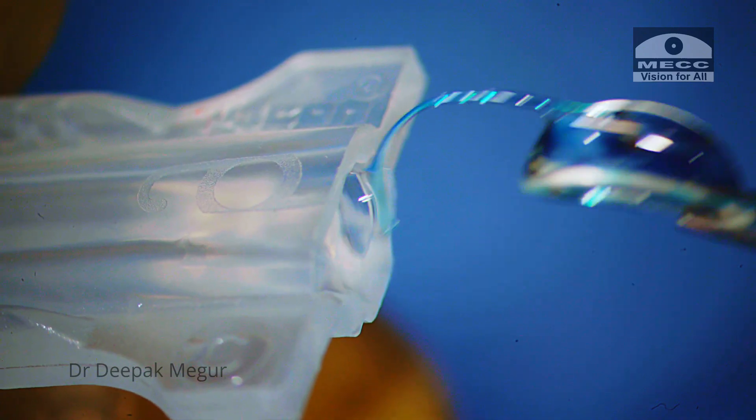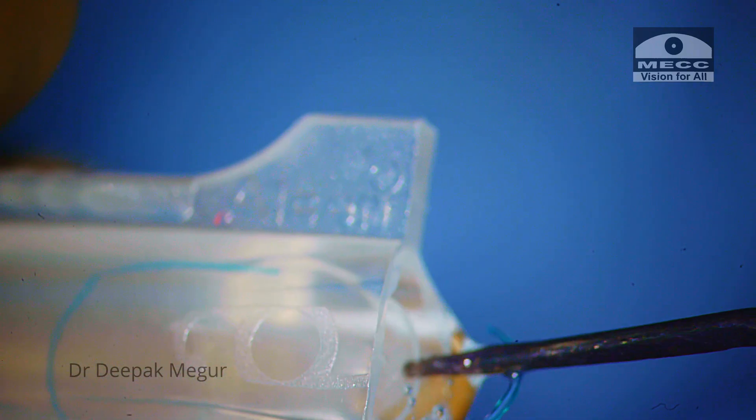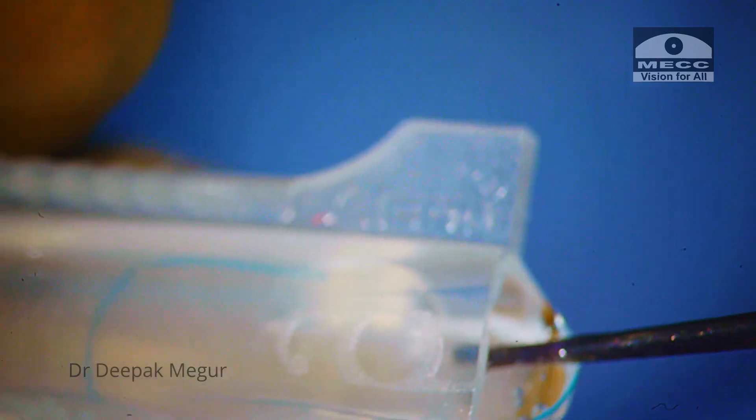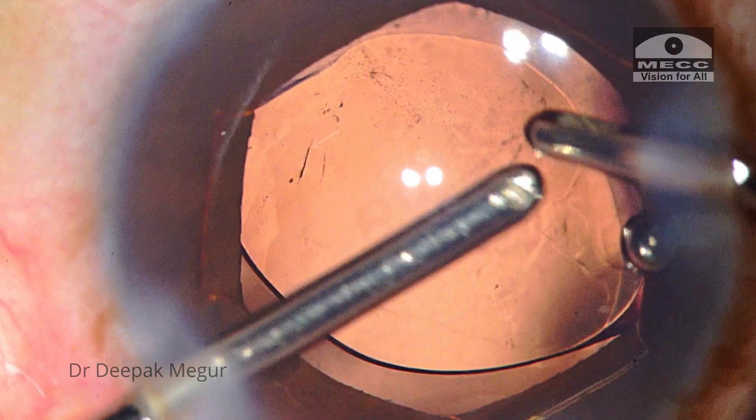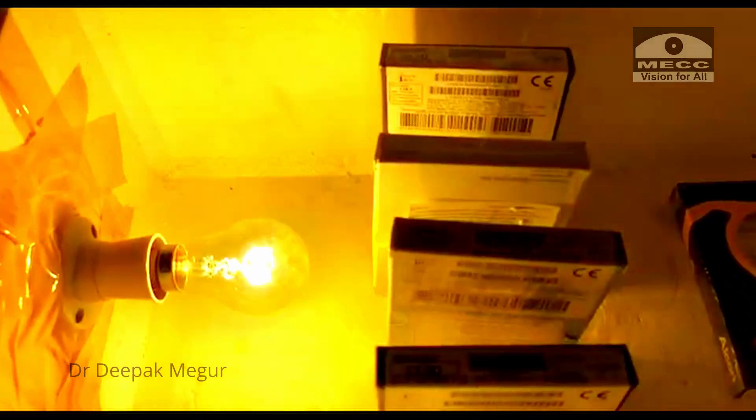We all know that hydrophobic lenses are quite stiff and get worse in cold environments. So when they're stiff, handling them becomes difficult and sometimes causes scuff marks as well. By keeping these hydrophobic lenses warm before implantation, handling of these lenses becomes very easy.